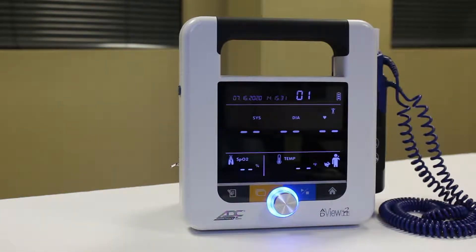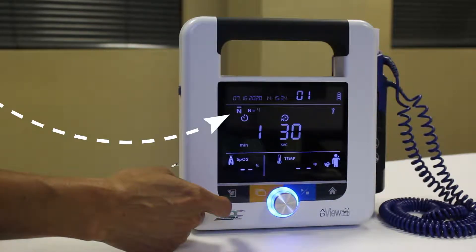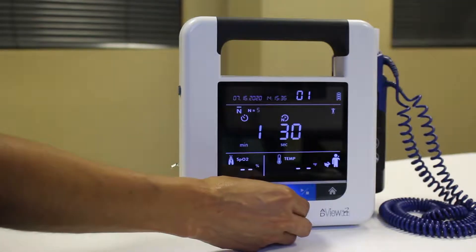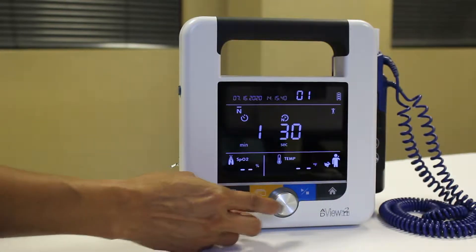Press the mode toggle button until you see the average mode icon. The number of measurements icon will flash, along with the selection knob. To keep the current setting, press the knob. To change the setting, turn the knob to choose a different number and then press. You can choose between 2 and 5 measurements.